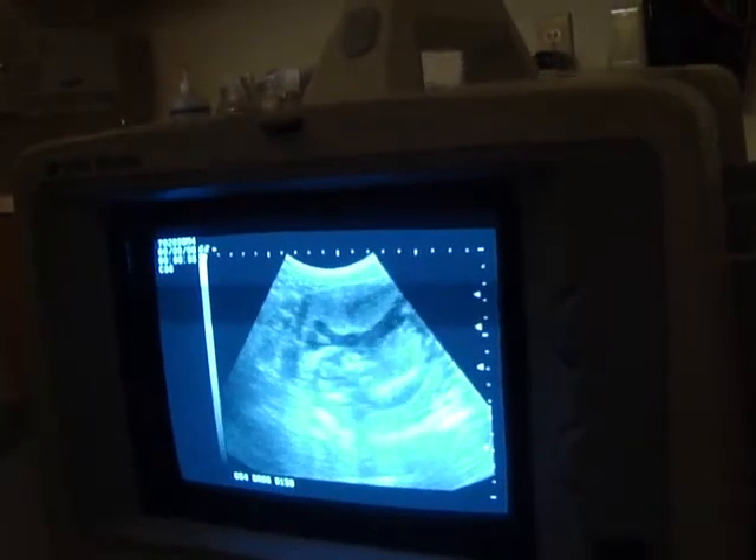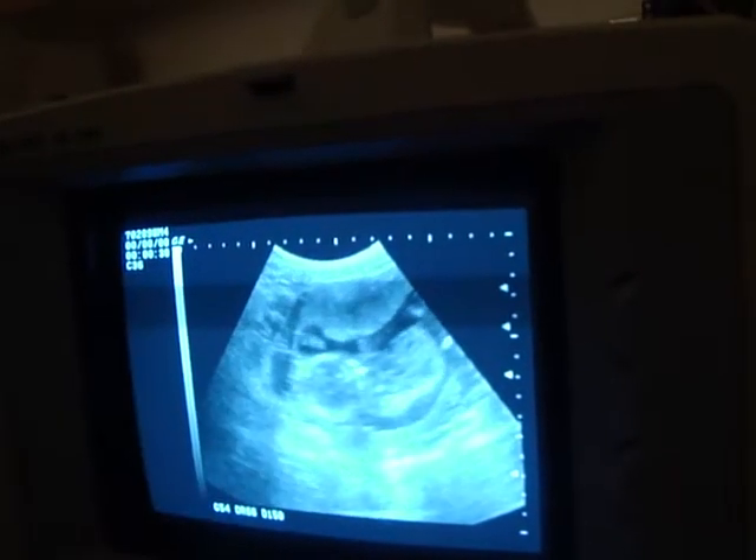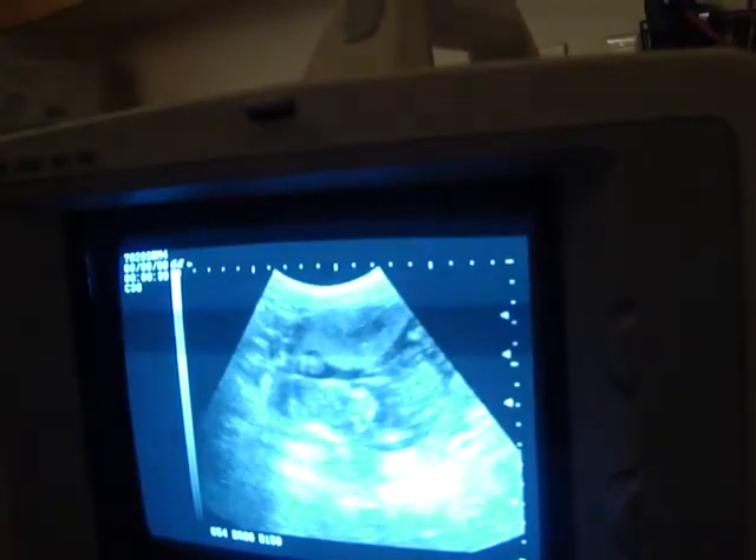That's a nice picture of the baby right there. So this little line is the spine and this is the head up here, runs down. This kid is really active.